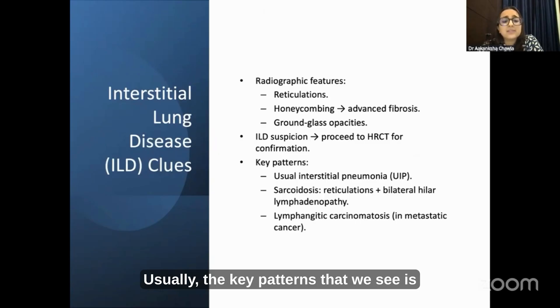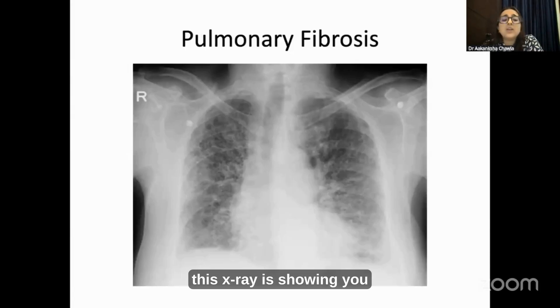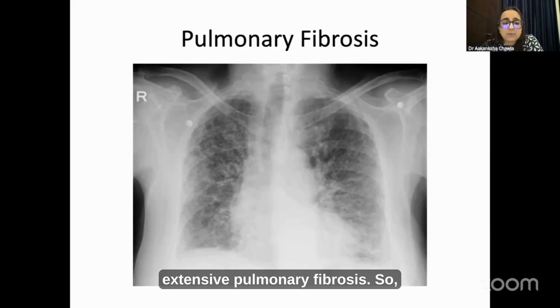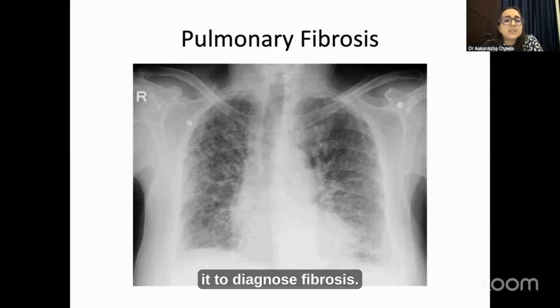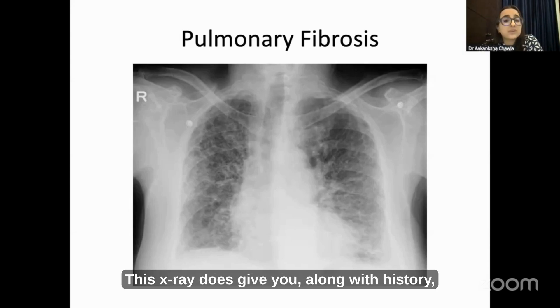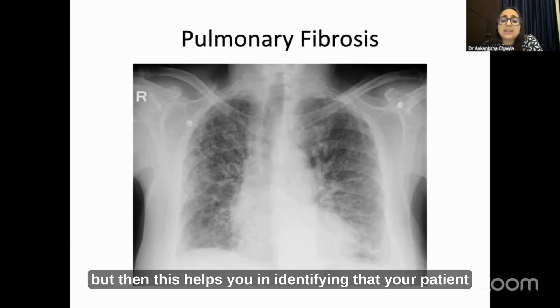Key patterns include UIP pattern in IPF, sarcoid with reticulations, bilateral hilar lymphadenopathies, and lymphangitic carcinomatosis. This X-ray is showing extensive pulmonary fibrosis. So don't always keep in mind that CT is going to be the only way to diagnose fibrosis — this X-ray combined with history and clinical examination can lead you to proceed to a CT scan.